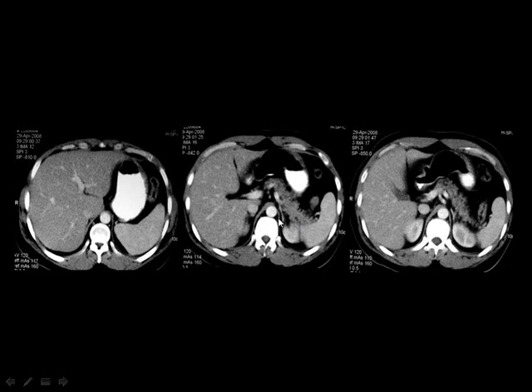And this is the diaphragmatic crura. The left crus is thinner compared to the right diaphragmatic crus. This is the aorta, and this is the IVC, this is the right kidney, this is the left kidney, this is the spleen, and this is the pancreas.